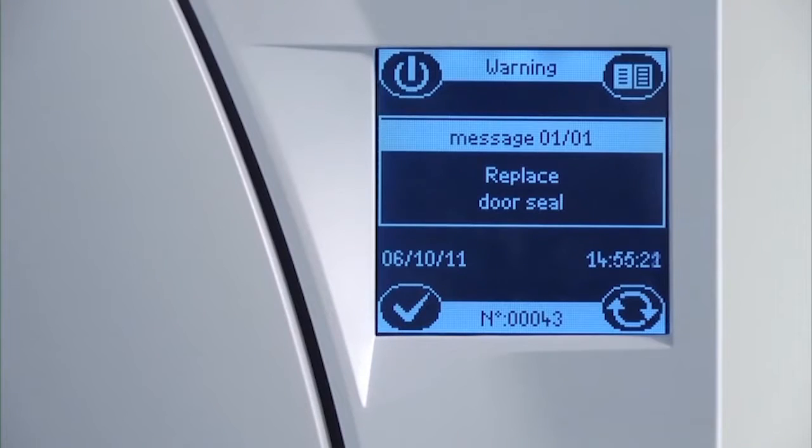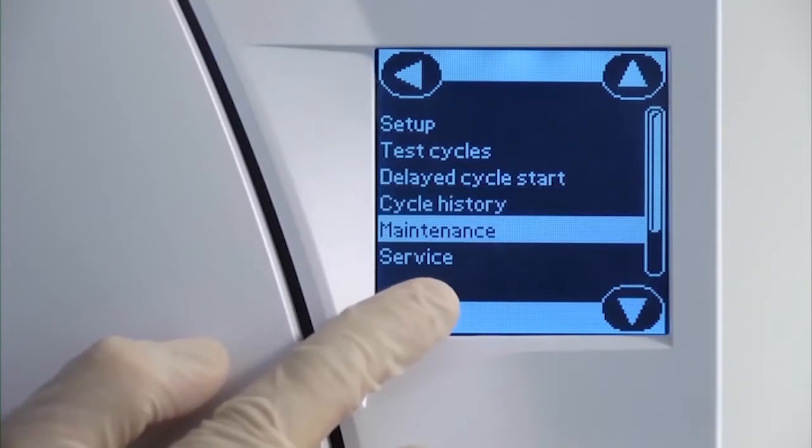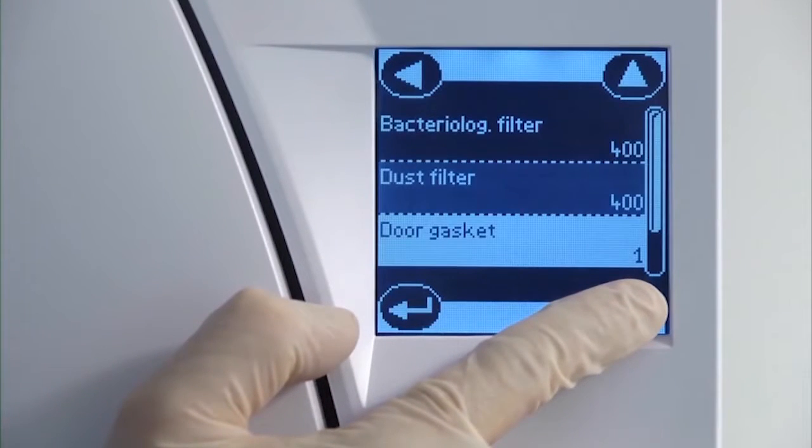Your Lisa steriliser will automatically prompt you when the life of the door seal has expired and needs to be replaced. Alternatively, you may view the number of cycles remaining for the door seal from within the maintenance screen of the menu.